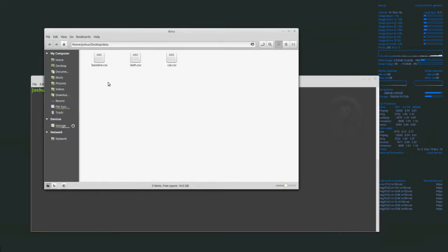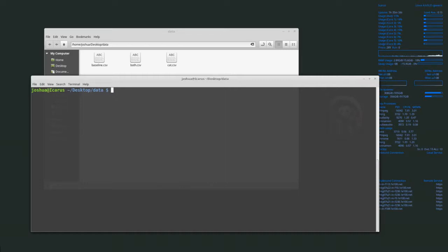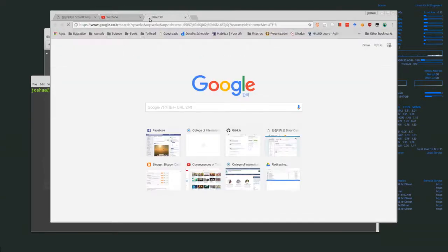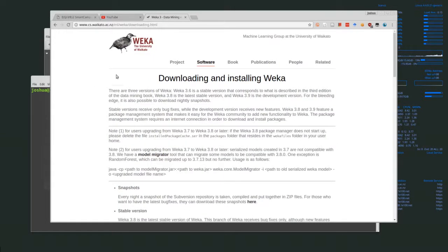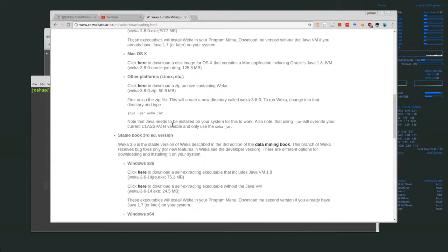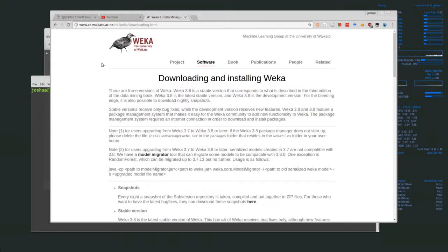Basically what we want to find out is whether we can differentiate between the baseline and actually detecting the cat. I have this both.csv file and I'll talk about that in a second. First thing to do is open up Weka. You can get it free from cs.waikato.ac.nz — download whatever version suits your operating system. I'm using it on Linux but it works the same on all platforms.